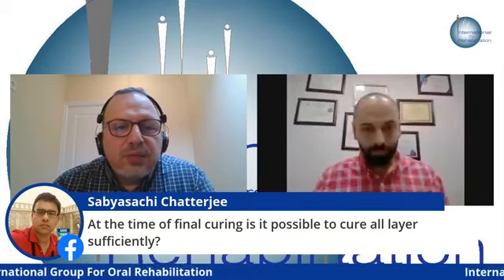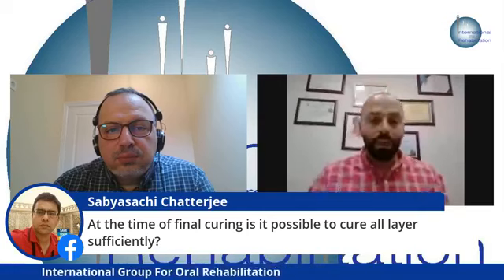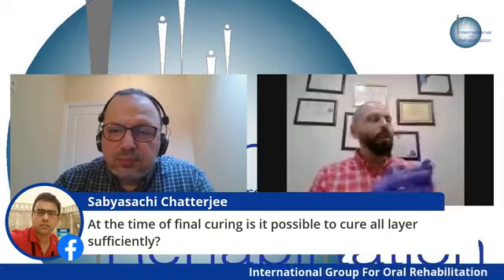Another question: at the time of final curing, is it possible to cure all layers sufficiently? Yes. If you imagine it, I do these 2 buccal cusps. I have a layer there. Then I add a layer at the middle cusp. Then I add a layer, and so on. So all these layers are sometimes at the same level, because I built each cusp alone. By the time I cure the first one, it takes the first second and then 5 seconds.